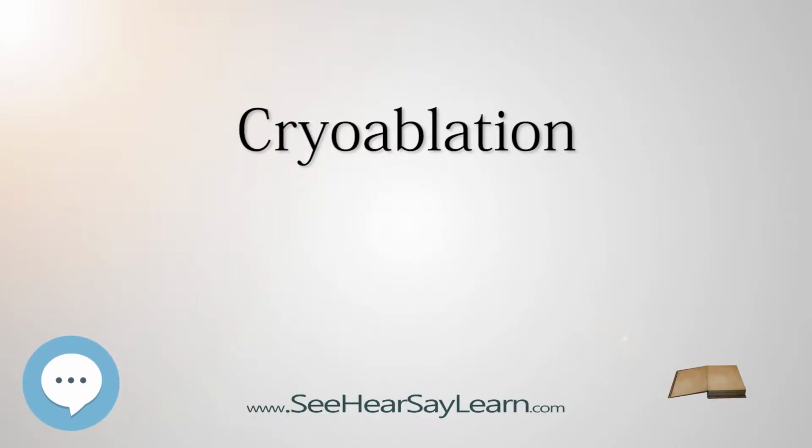Cryoablation is a process that uses extreme cold to destroy tissue. Cryoablation is used in a variety of medical uses, using hollow needles, cryoprobes, through which cooled, thermally conductive fluids are circulated. Cryoprobes are inserted into or placed adjacent to tissue which is determined to be diseased in such a way that ablation will provide correction yielding benefit to the patient.